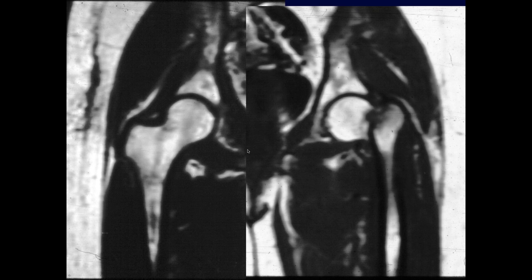Unfortunately, we didn't get the MR earlier, and in those days, we did not have PD-FATSAT images. In fact, they had just come out with STIR images at this particular time. What we could see with the MR scan was a displaced fracture, and obviously, you'd be able to see this with both the plain film and the CT at that particular time.